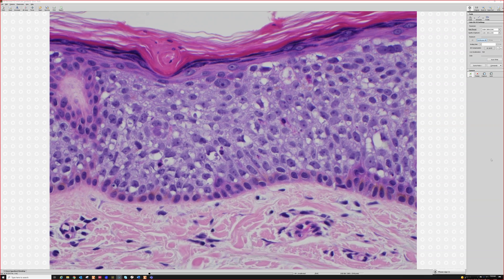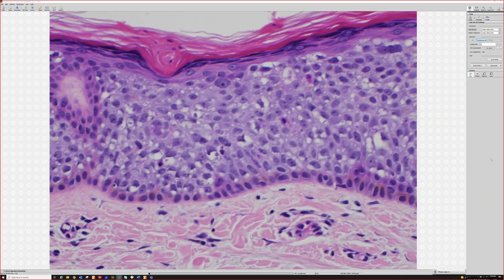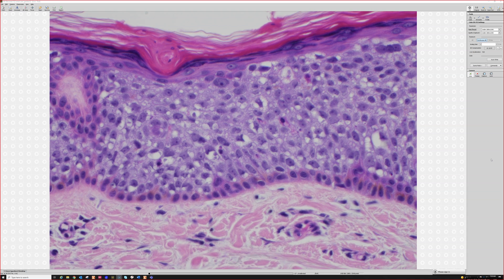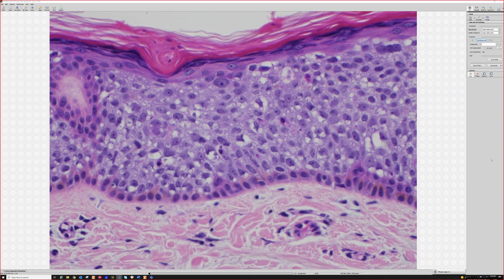Now, what do we do with all these vacuoles? Look — these are clear vacuoles indenting and scalloping the nucleus. I've taught you before that when you see clear vacuoles that push into the nucleus, that means they're lipid vacuoles. A malignant carcinoma with lipid vacuoles we always teach is sebaceous carcinoma. So should I call this sebaceous carcinoma in situ?